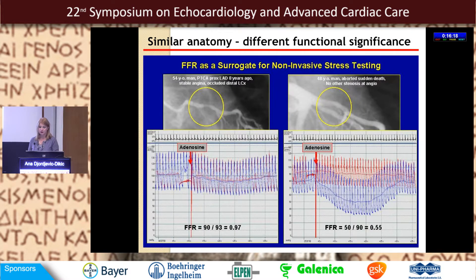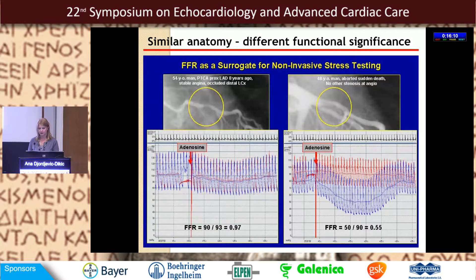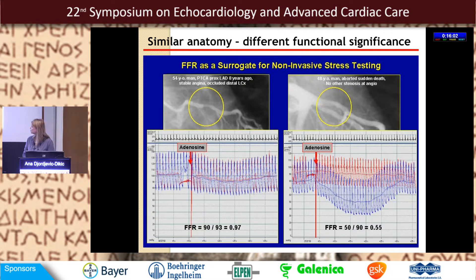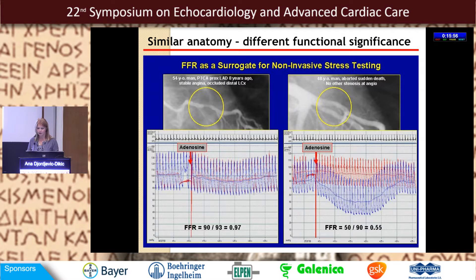Here we have similar anatomy with different functional significance. In these two pictures of epicardial artery, you can see that on one side the stenosis seems more severe but the fractional flow reserve is good, while the other side looks better on eyeballing but the fractional flow reserve is lower.